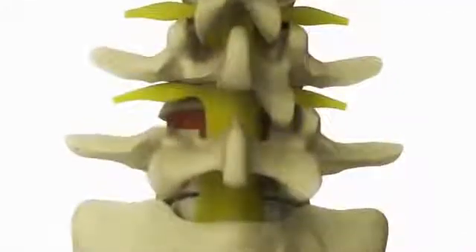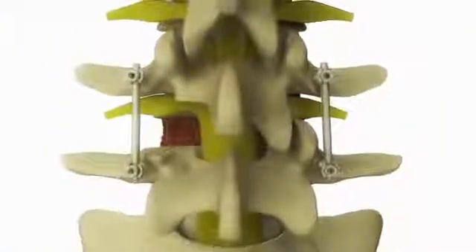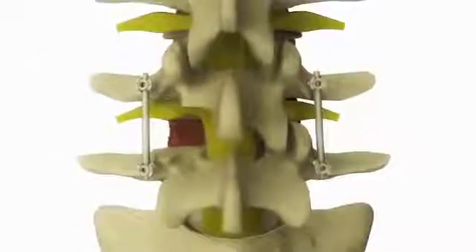Then on the back part of the vertebrae, small screws called pedicle screws are inserted into the bone and connecting rods are inserted into the screws to give the spine extra stability.